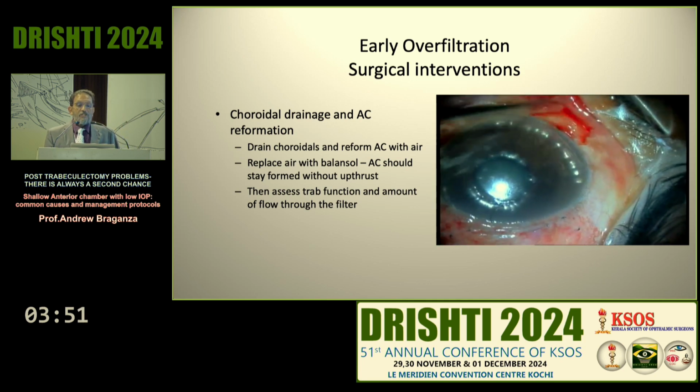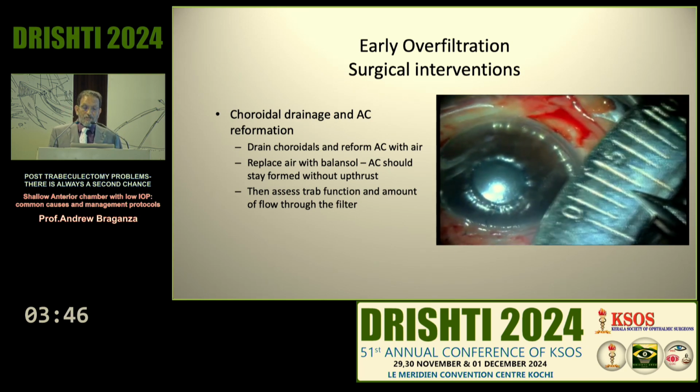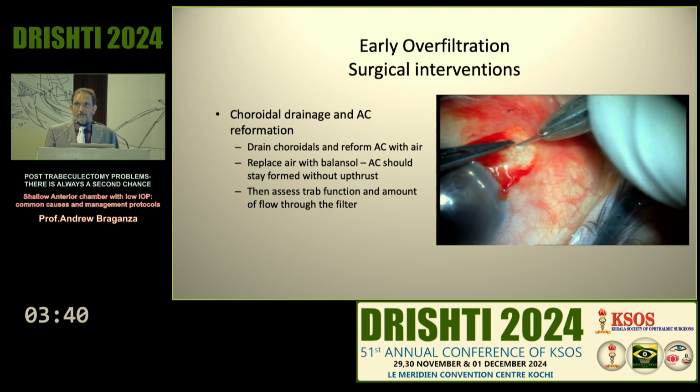The choroidal drainage is shown here, where it's a fairly simple procedure. You can't do it under topical, you do need to have a full peribulbar or retrobulbar block.